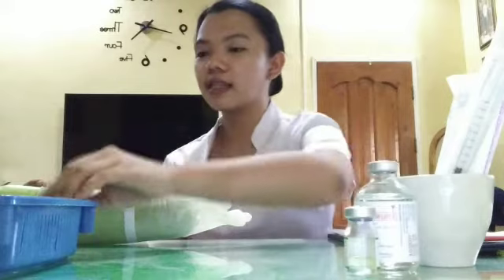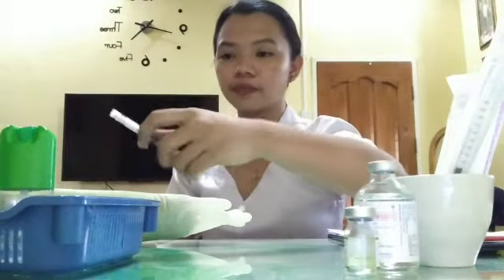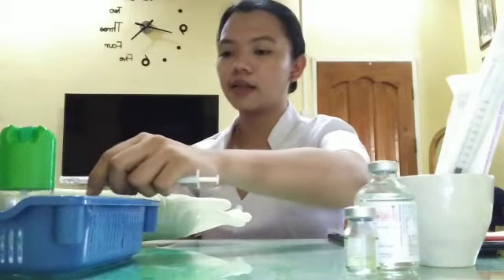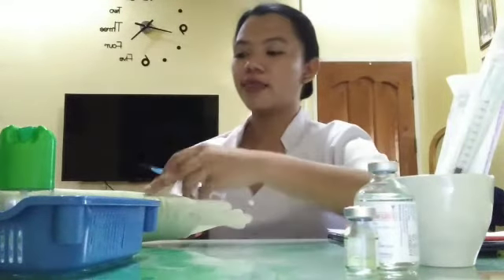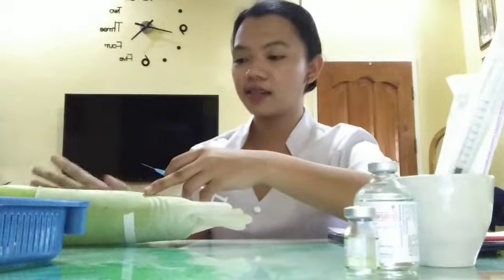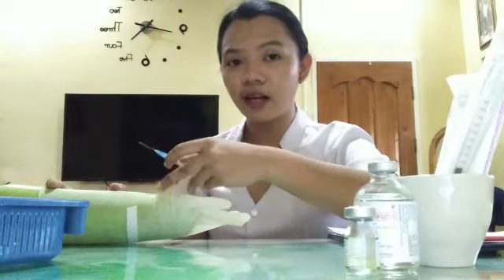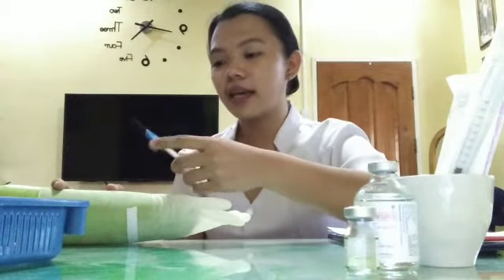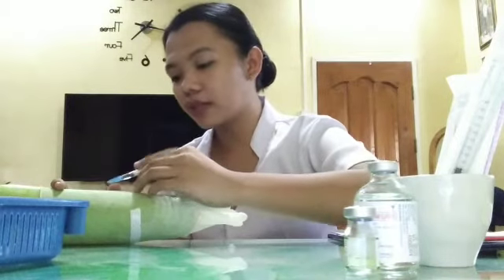Next, we will grab the injection, and then we will uncap, and then we will put our non-dominant hand and stretch the skin of the patient, and then we will inject.